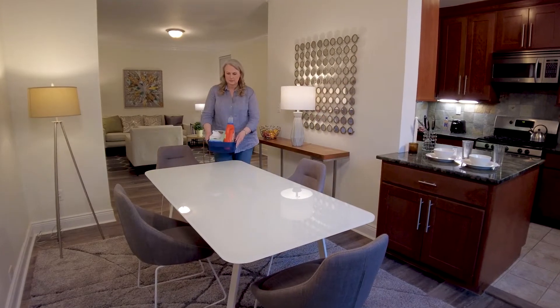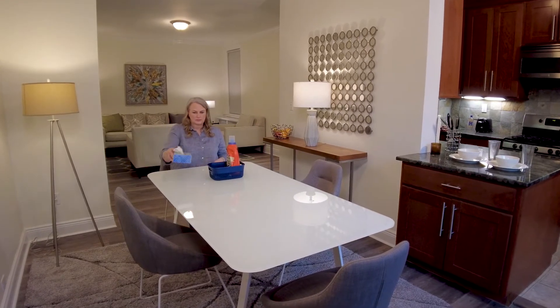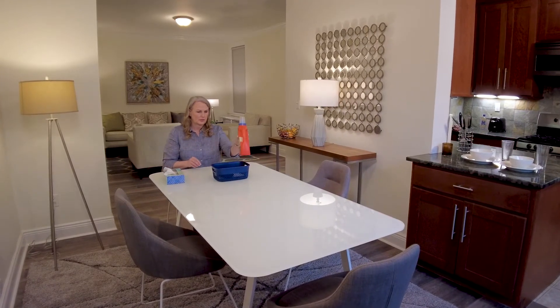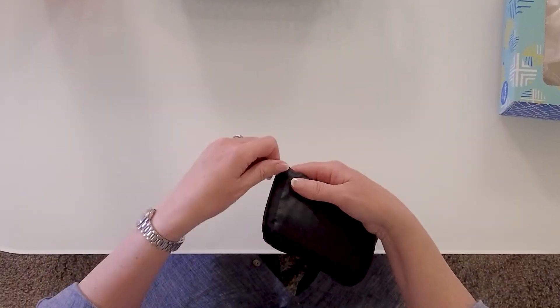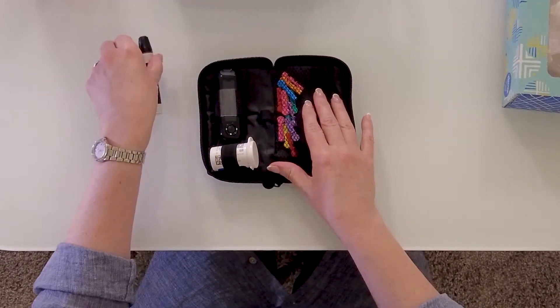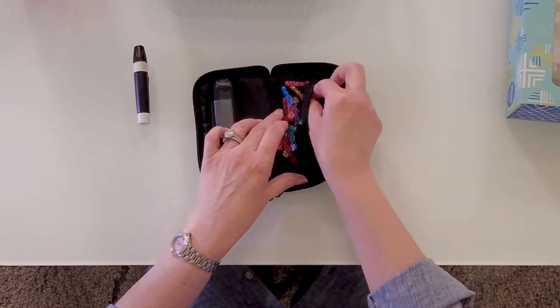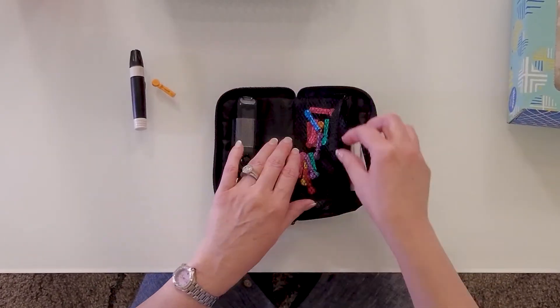Next, set up your supplies on a clean surface. It's helpful to arrange them in the order you'll use them. You'll need your lancing device and lancets. You'll use these to prick your finger to get a small drop of blood. Use a new lancet each time you check your blood sugar.